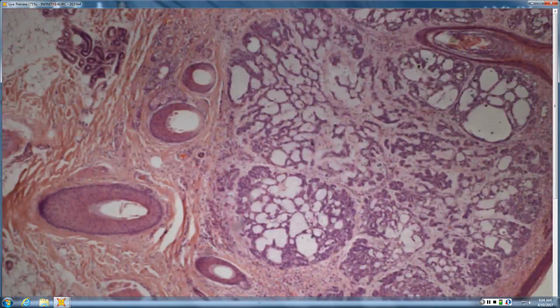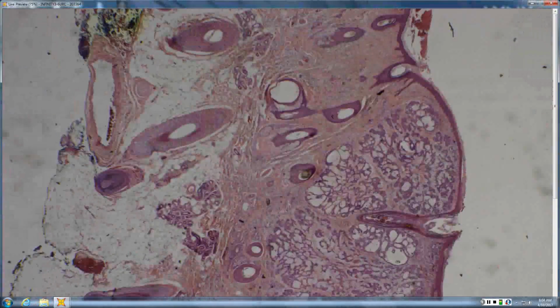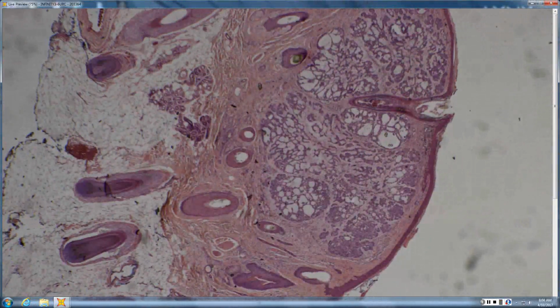And the history was they had pulled a tick off. So it's another mimic that in this case was arthropod. We didn't see any mouth parts. There were lots of thrombi, which certainly will go with it. The bulla is a little bit of a red herring. That would be unusual. Lots of bullous arthropod, but not usually bullous tick.